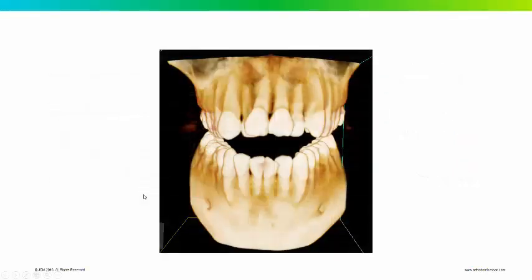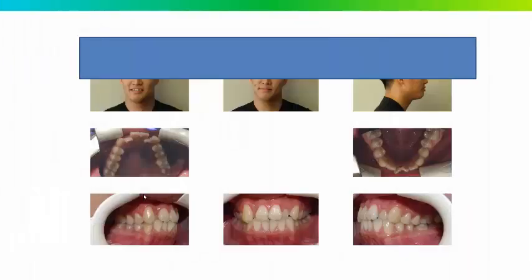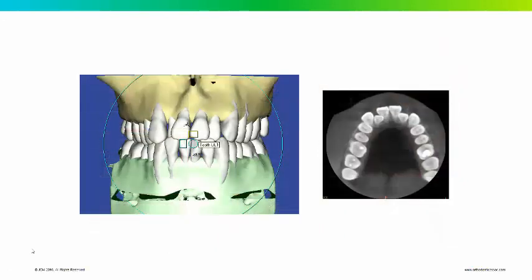This is another case that's actually fairly similar. This case is Class II Division I, sub-left — Class I on the left, Class II on the right. It's a lingually locked incisor. He's a 29-year-old male. This is a 3D reconstruction; I took the cone beam and uploaded it to Ormetrix, which allows for simulation of orthodontic treatment. You can see that he already has some dehiscence, but this is not an orthodontic dehiscence pattern — this is just a natural pattern because he has a lack of space for all the teeth to line up.